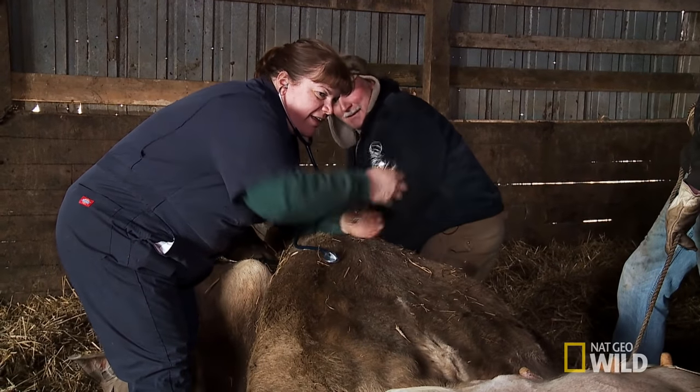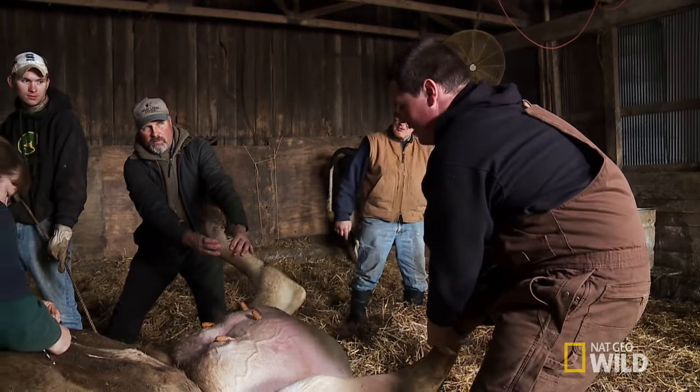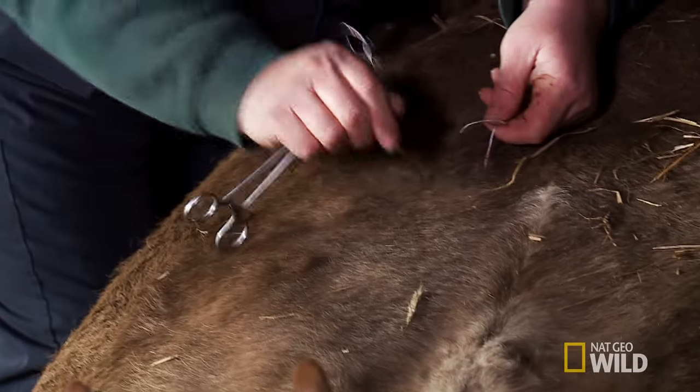You want to go take your whole body and stand on this side. Because otherwise, your face will get clocked. We're going to suture her stomach back into place, and then we roll her on through.